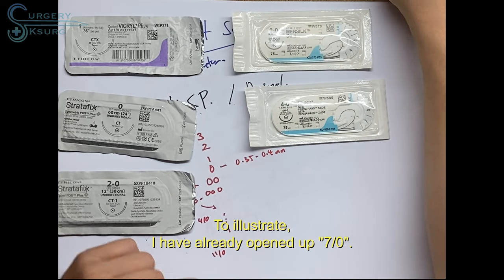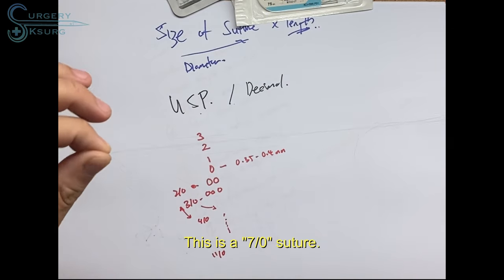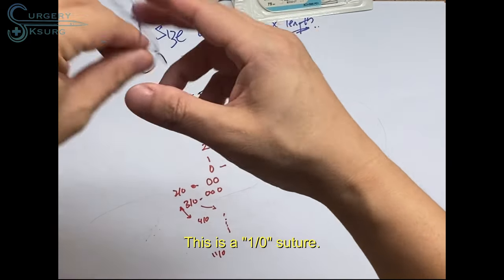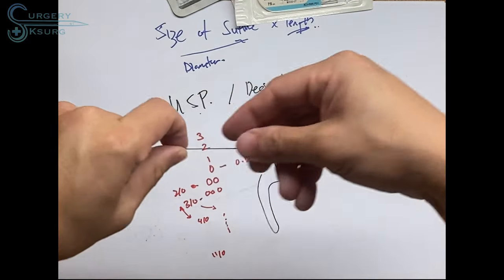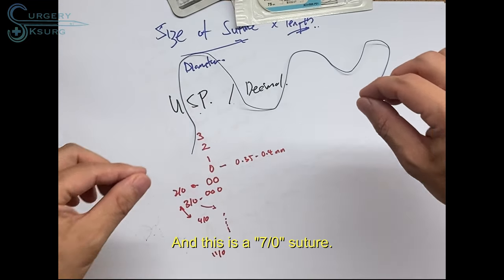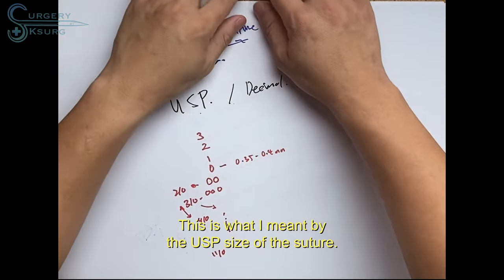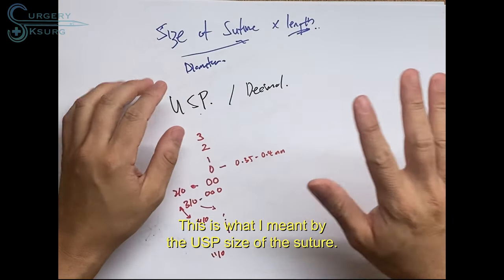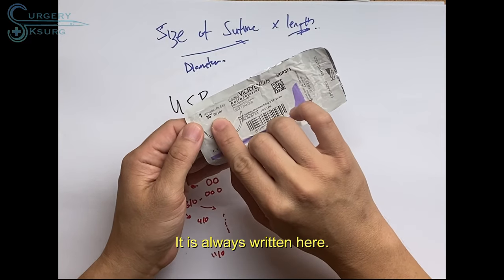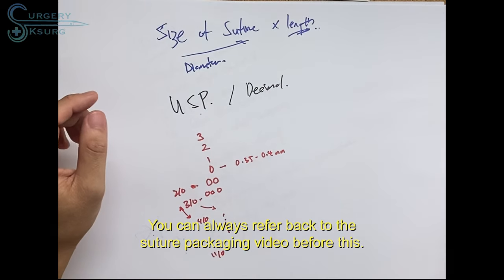To illustrate, I will open up a 7-0. This is a 7-0 suture. Can you see it? And this is a 1-0 suture. So this is a 1-0 suture, and this is a 7-0 suture. You can actually see the difference. This is what I meant by the USP size of the suture. The length of the sutures, on the other hand, is different. It's always written here. You can always refer back to the suture packaging video before this.